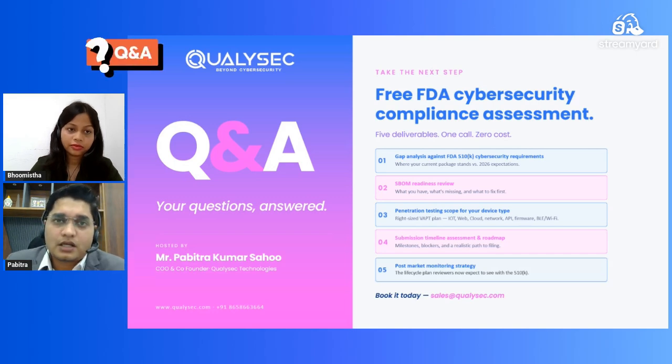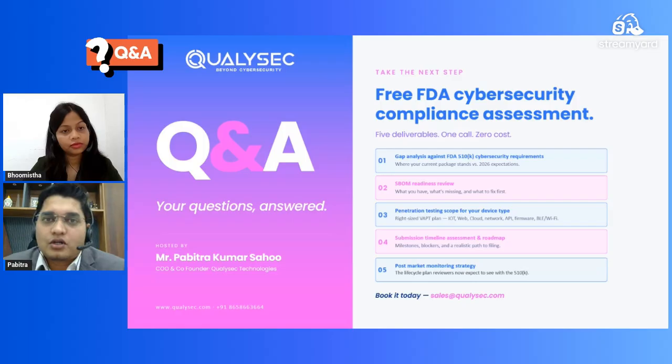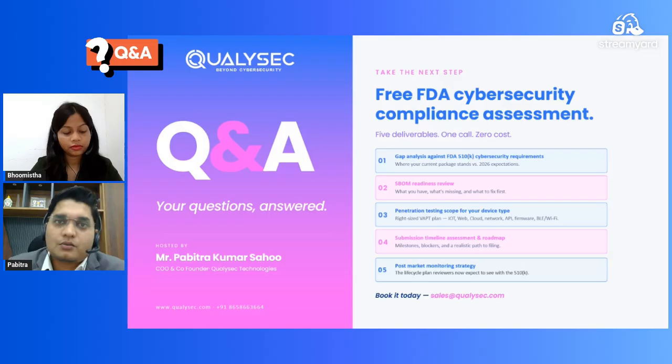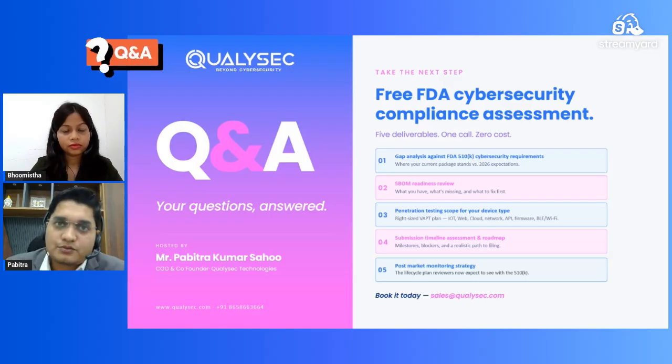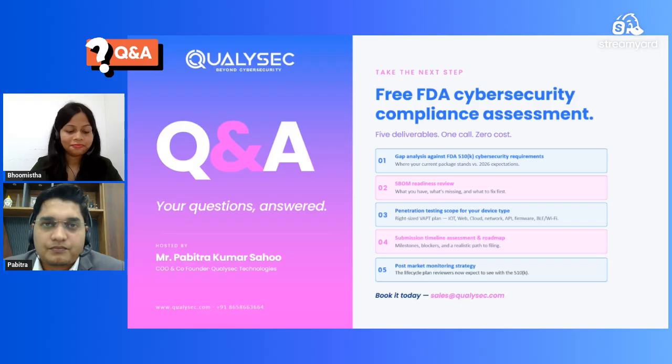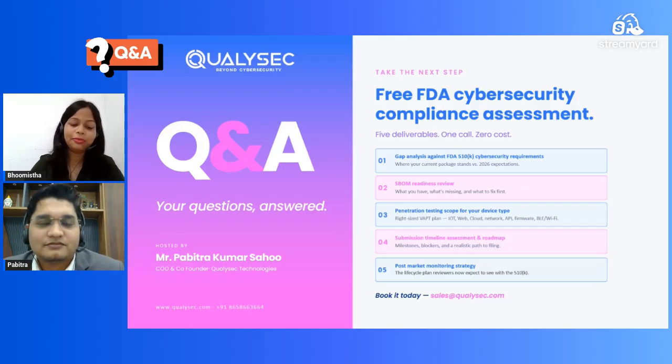Even the routers, if you are using different routers to access different LLMs, you have to mention in the SBOM itself, in a separate section, because AI is also part of the supply chain attack surface. Yes, sir. That answers whether we can show our AI as a part of the SBOM report. I think that's the end of our question and answer session.